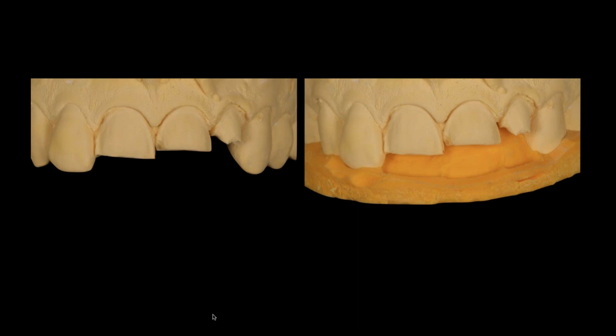And I know most of you are thinking, well, this is where opaque dentins come in, and this is where other materials that have a lot of opacity come in. I'm going to restore this feldspathically, by the way, which I believe was the best option for this case because I have 0.2 of a millimeter facially on those preps, but I got 5 millimeters everywhere else. And the challenge is, what material would you pick to do that?